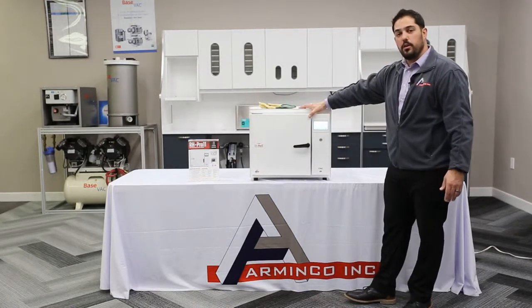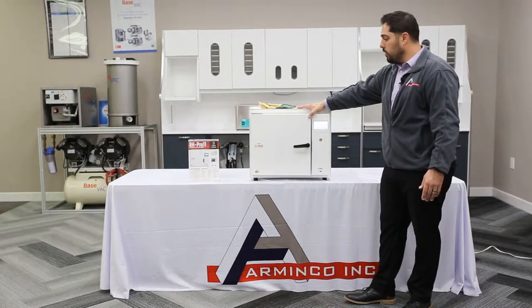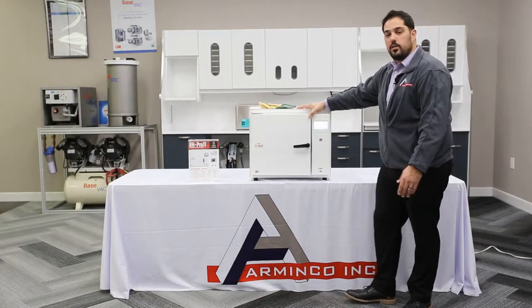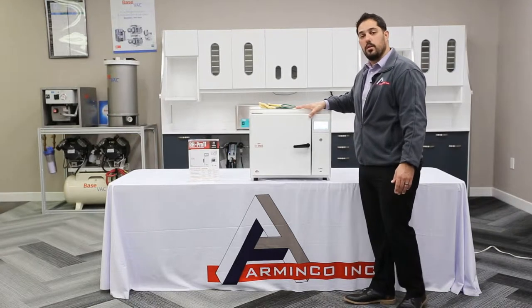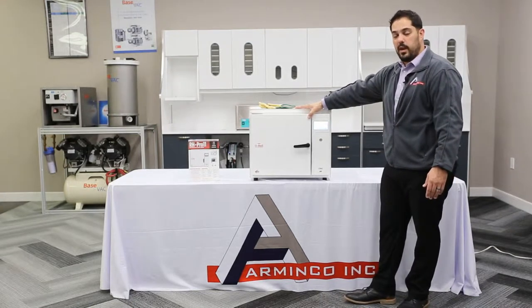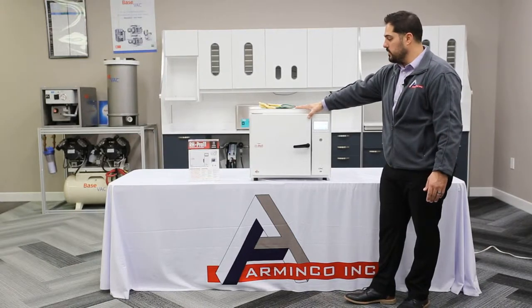This unit actually gets up to 375 degrees, which will inherently sterilize all of your equipment, offering you that kill rate that you need in order to make sure that all of your hand pieces and equipment is 100% sterilized.